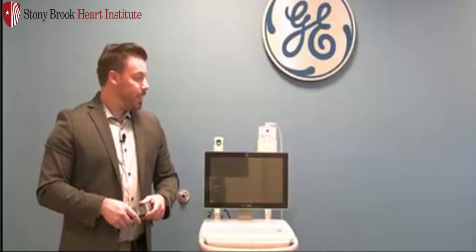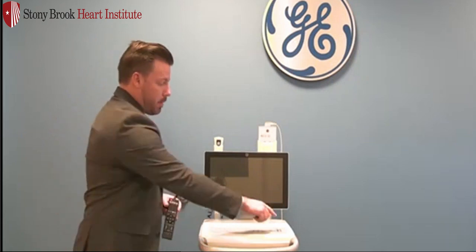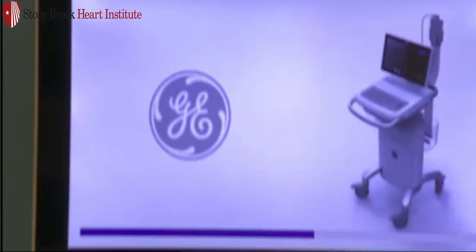Hello, welcome to the MacView 360. In this episode, we're going to go through how to acquire an ECG with your new cart. To power it on, on the top right corner of the keypad, press the power button. The system will take about 30 seconds to power on.